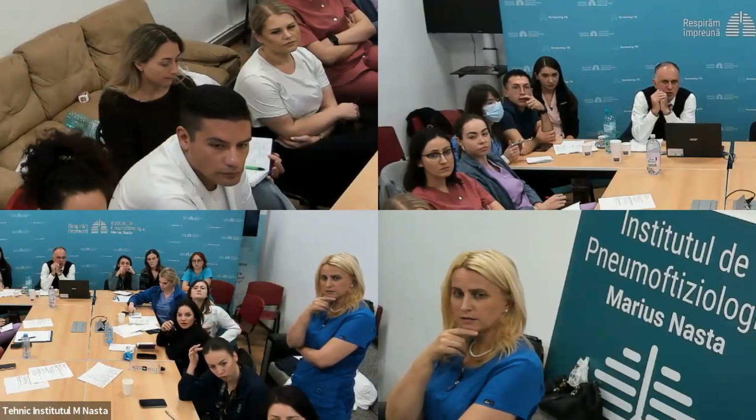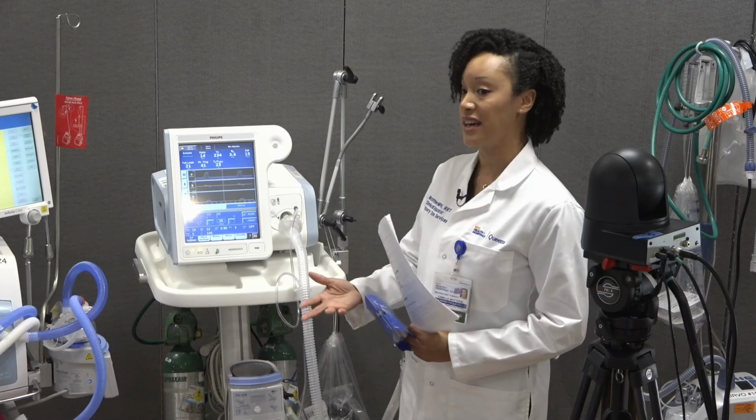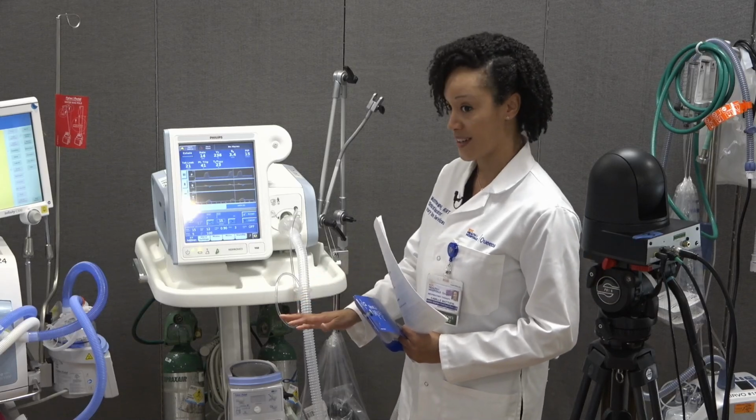They want to increase the volume. If oxygenation was an issue and you gave the recommendation to go up to 8, you guys did 20/8. You actually accounted for the pressure support, which was good.